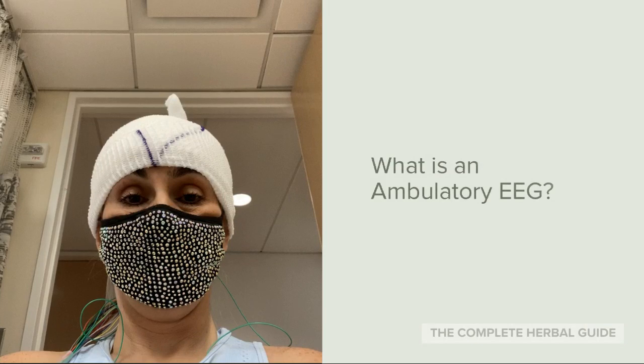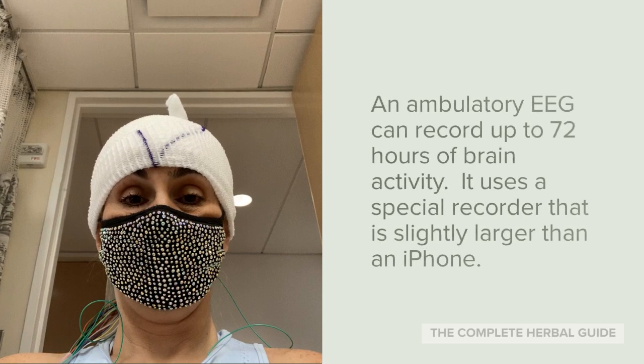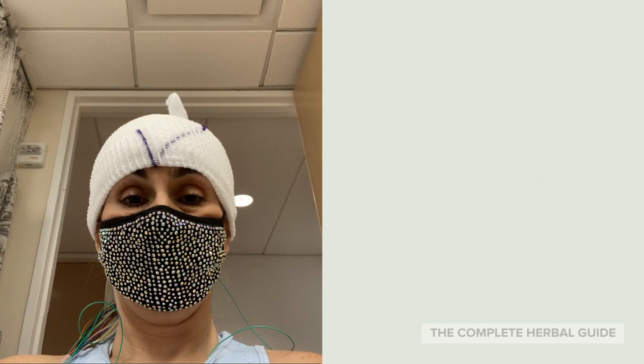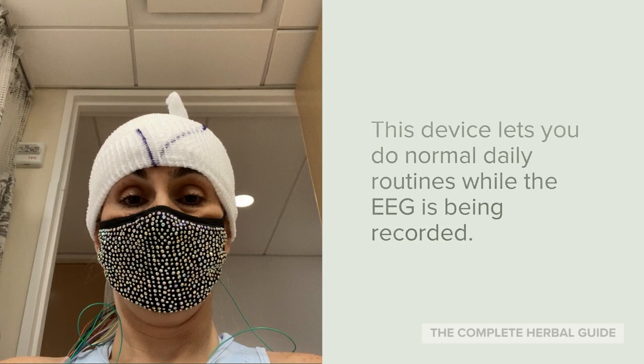Many people ask me: what is an ambulatory EEG? An ambulatory EEG can record up to 72 hours of brain activity. It uses a special recorder that is slightly larger than an iPhone. This device lets you do normal daily routines while the EEG is being recorded.